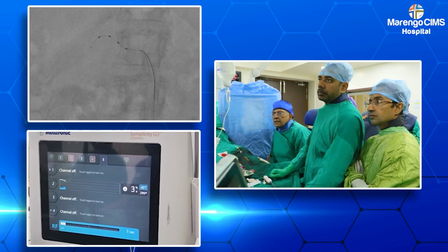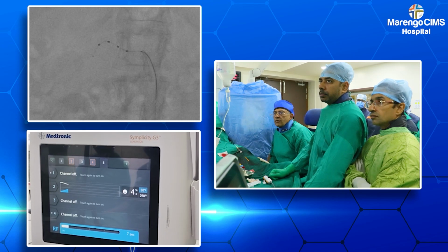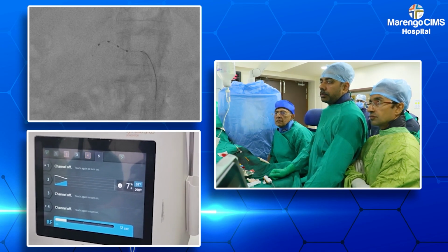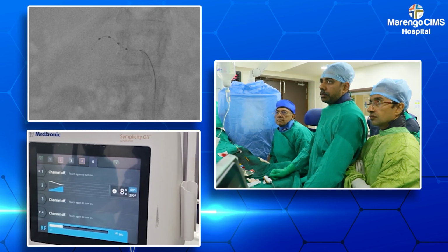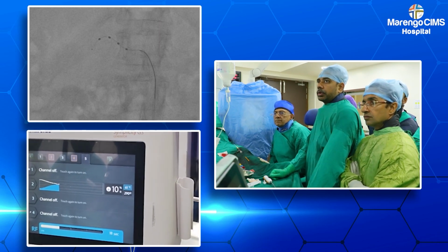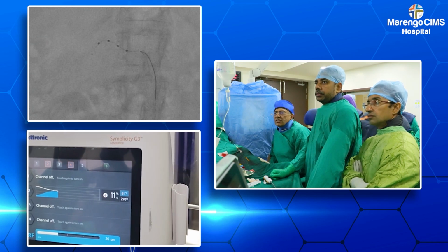Looks okay. Temperature is 47, rising 48, 50, 51, 53. It's very steady around 60.